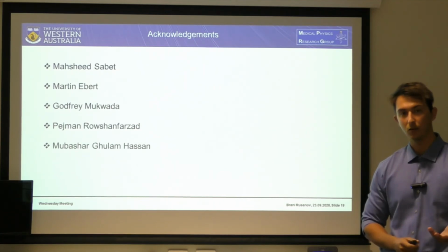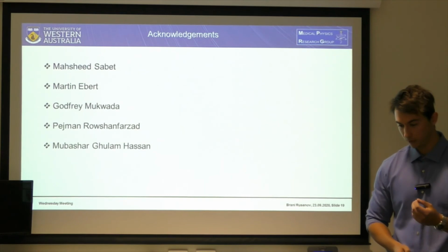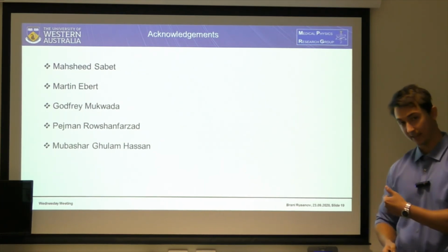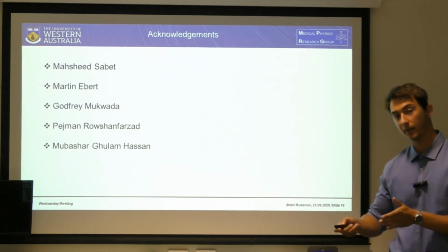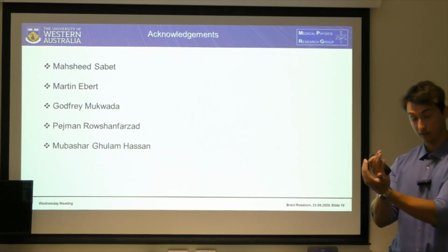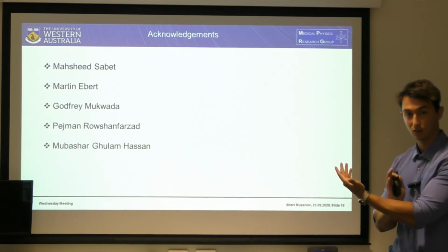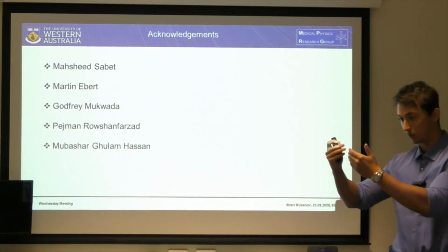In the projection domain, or? Yeah, in projection. Well, typically, the other kinds of intensity deviations are from the flat panel detector. It may not be uniform. And in the a priori method without machine learning methods, that is corrected for, because when you subtract the two, the no scatter signal versus the virtual CT from the raw cone beam projection, that's automatically accounted for.